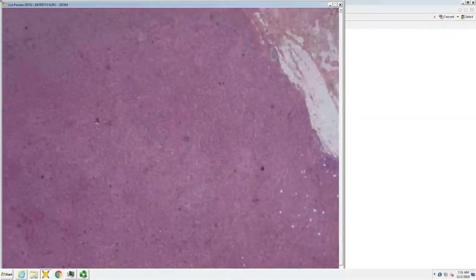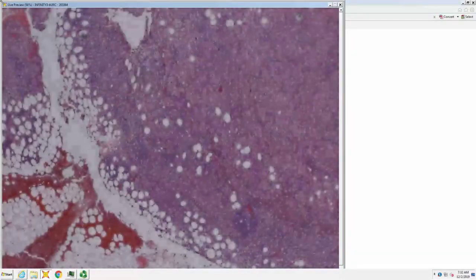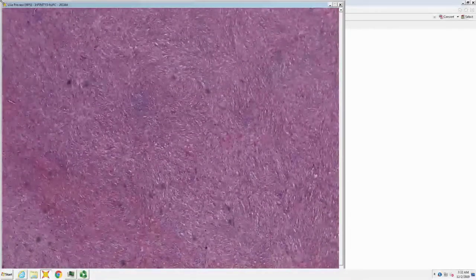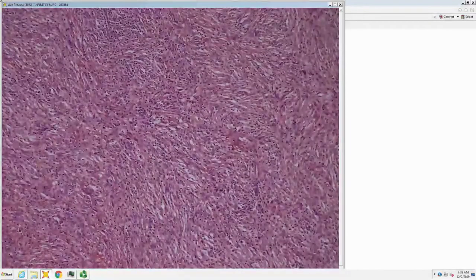It's big. You know that's probably a DFSP. So it does look DFSP-like, and you'd want to know how it started life. It also, though, has lots of dense cellular foci. So you'd want to see, number one, are they neutrophils?